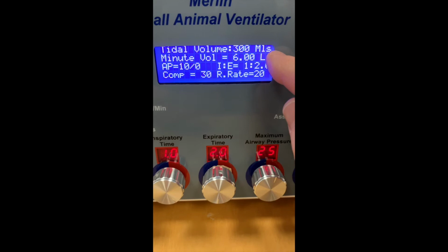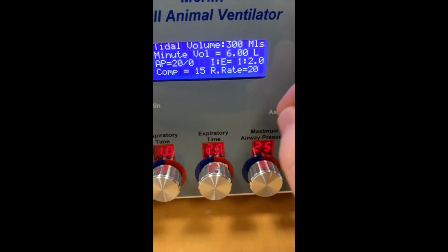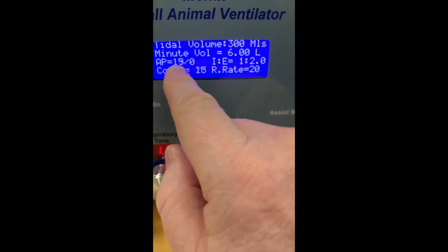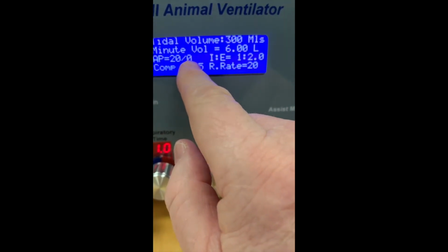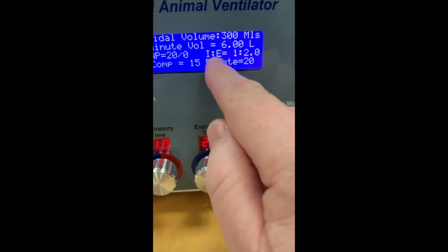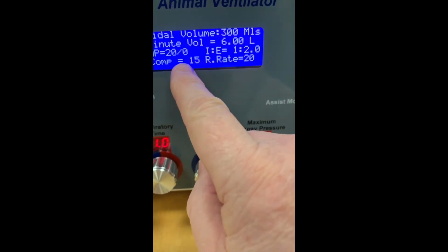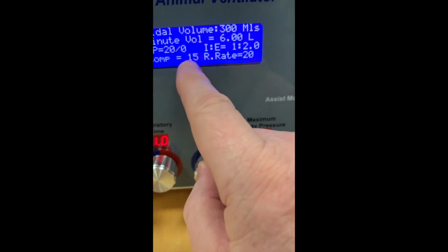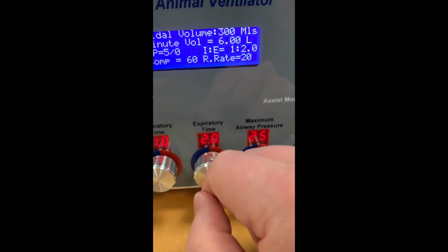So a minute volume of 6 litres as derived from a respiratory rate of 20 and a tidal volume of 300. Our airway pressure is going up to a peak inspiratory pressure of 20 as the first value, and after the slash we have 0, and this would indicate the PEEP value. At the moment there is no PEEP, so this is 0. Our IE ratio is 1 to 2, and the compliance is measured, in other words the dynamic compliance of the patient is coming out at 15, so it's 15 mils per centimetre of water pressure. And as I said, the respiratory rate is set to 20.